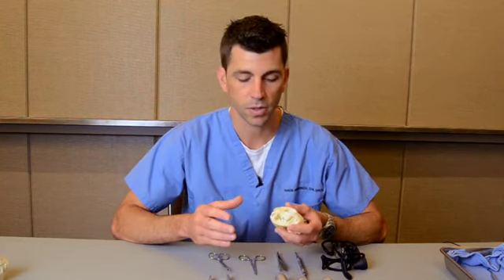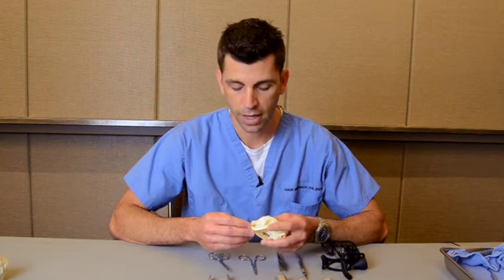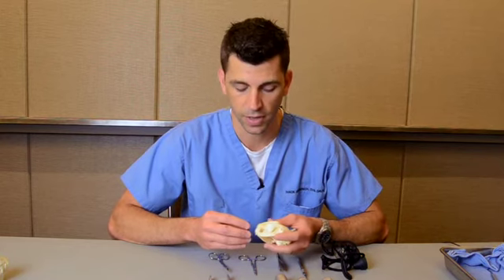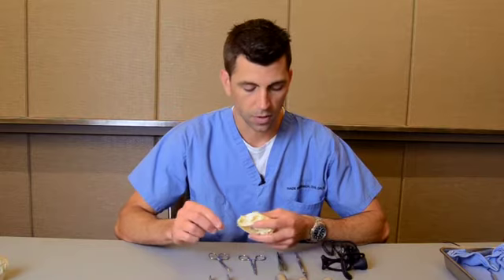First of all, you need to understand that feline dental extraction is really microsurgery. So it requires special instruments beyond what we would typically use for a medium to large sized dog. The small cat is a completely different beast. Okay, and we need to make sure that we've got the appropriate instruments to deal with the challenges that we're faced with. First of all, I want to talk about magnification.